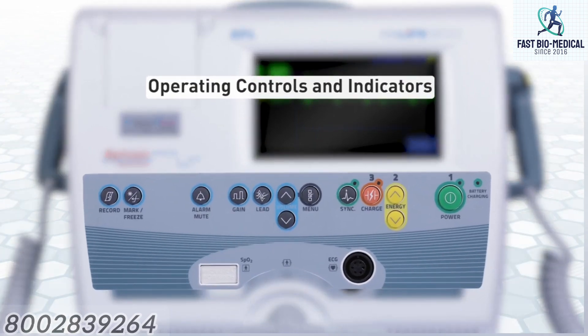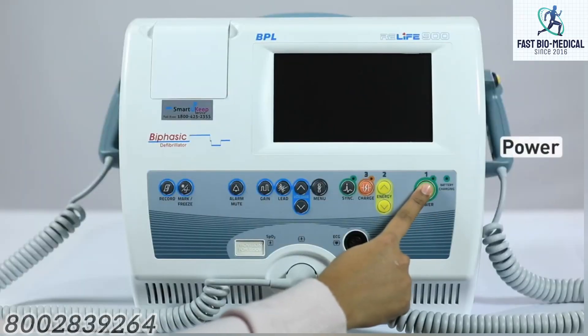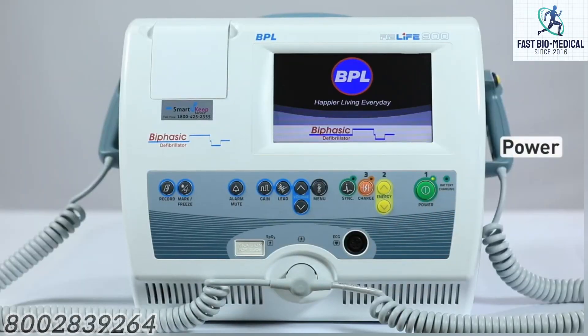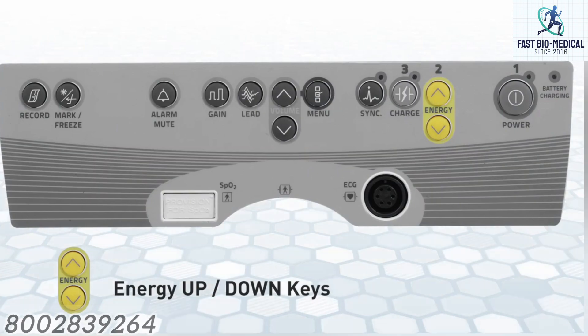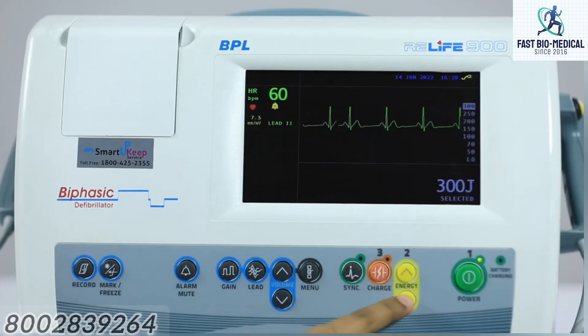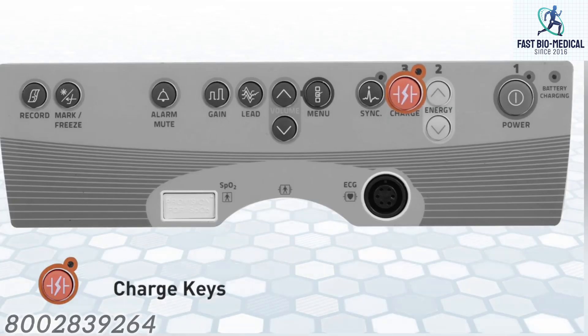Let us look into the operational controls and indicators. Power: to switch on the defibrillator, press the key once. When switched on, the LED located in this key is illuminated. Energy up/down keys: when any of these keys is pressed, a menu appears on the screen indicating the various energy levels. Pressing the up key selects the next higher level, and pressing the down key selects the next lower level.